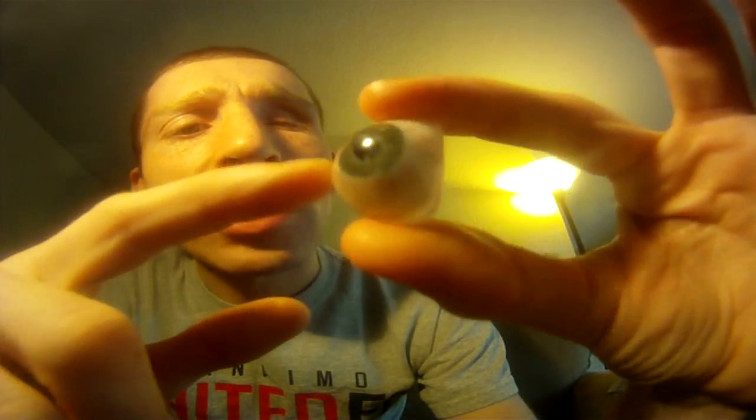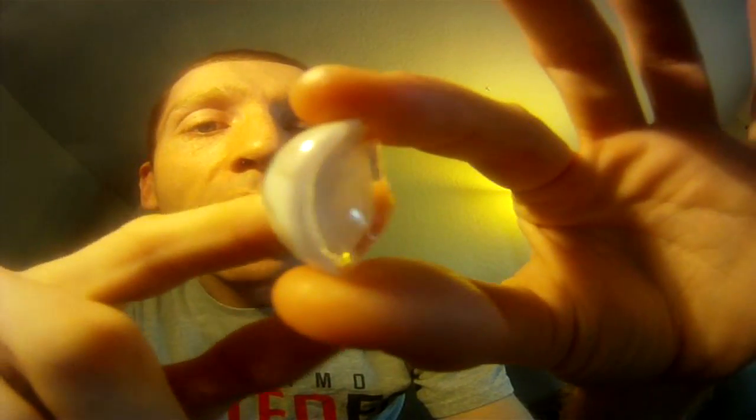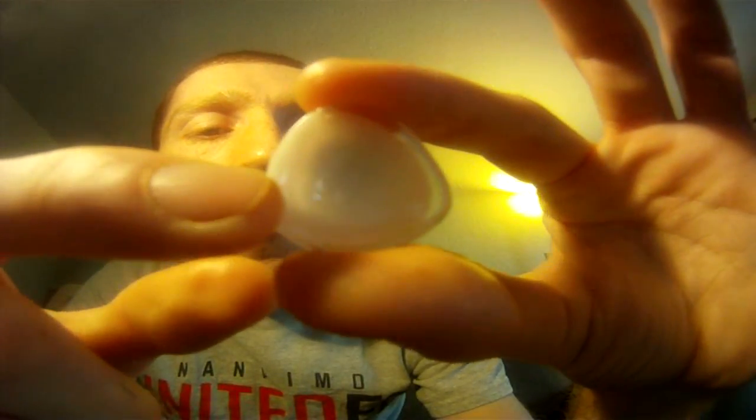Hey guys, I just wanted to make a quick video answering a couple of questions that I hear a lot about my prosthetic eye. First, I wanted to show you a close-up of my eye. I'm not really sure if you can see this, but the woman that made my eye actually hand painted the blood lines and the color of my eye. So it's very customized.